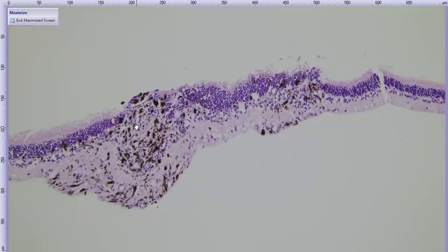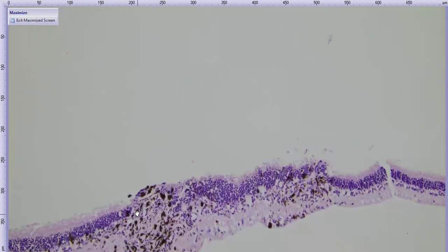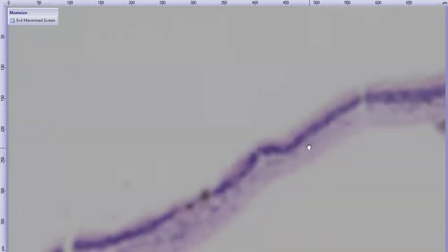And this pigmented spot is associated with outer to full thickness retinal atrophy, focally or multifocally, basically. We don't really have many of the recognizable layers of retina where all these pigmented cells are. And right adjacent to it, where it would have been theoretically attached, we have a hypertrophied looking RPE. So maybe a little tiny focus of retinal detachment and atrophy here. It's looking pretty similar at the site adjacent.